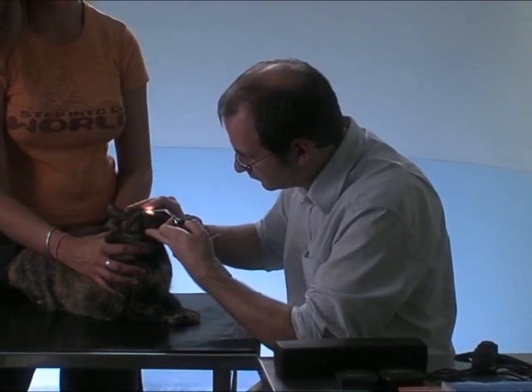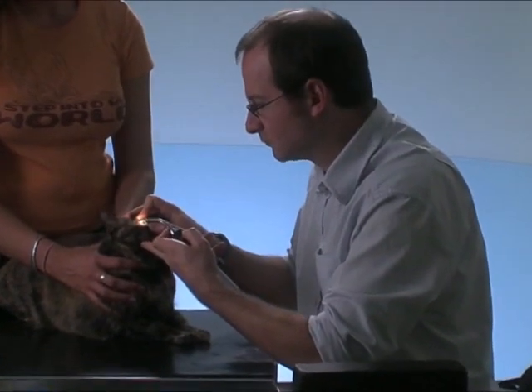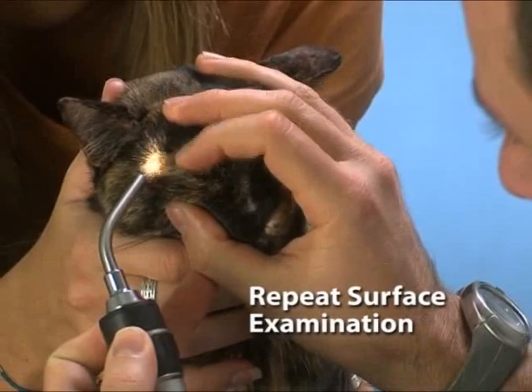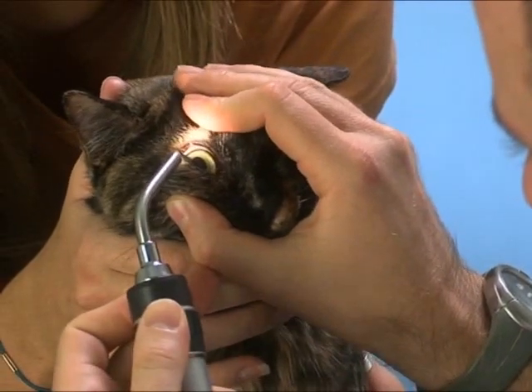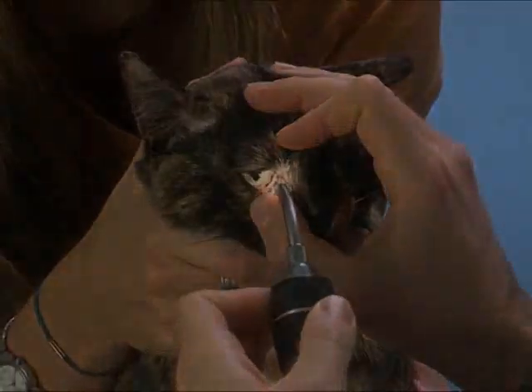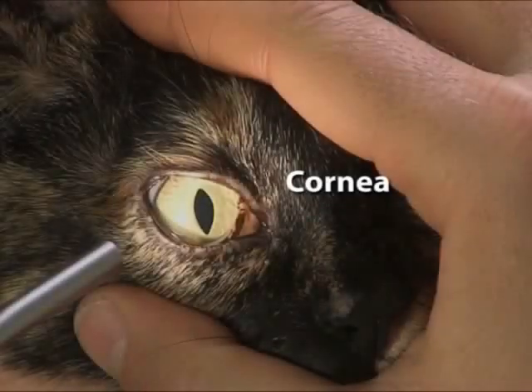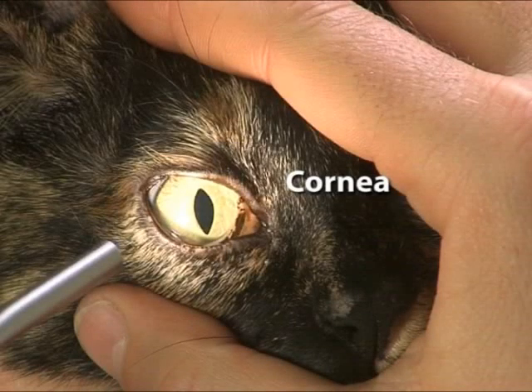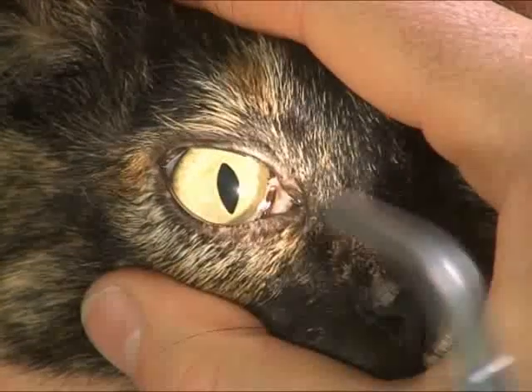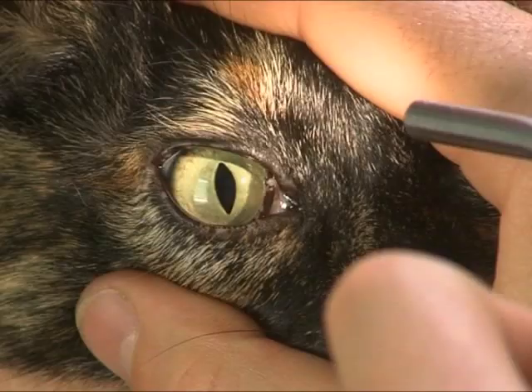To examine the eye with a light source, the room lights should be lowered or turned off. Begin by re-examining the superficial ocular structures. Some lesions may be more obvious under illumination. The cornea should now be thoroughly inspected. In examining the cornea, it is important to understand the factors that determine its normal appearance.